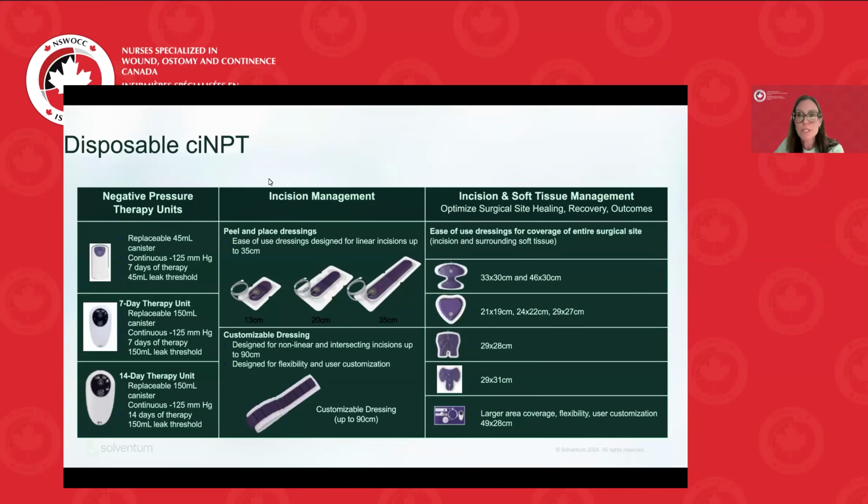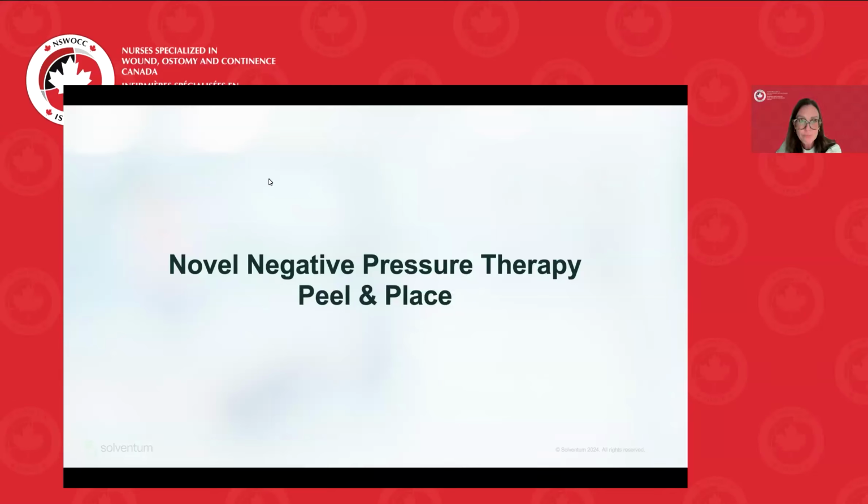Lots of different shapes, sizes, and wear time. So essentially 7 to 14 days. You can see, depending on the area that you are looking at for the surgery, the different options that you have there. I do recommend, if you aren't familiar with that yet, to look at that. At first I started using the linear ones and then I saw some of the other ones and it really opened my mind.